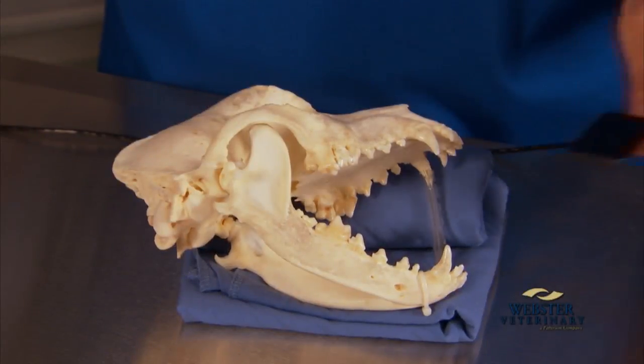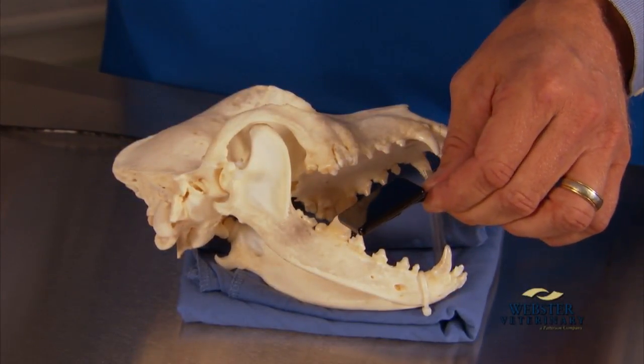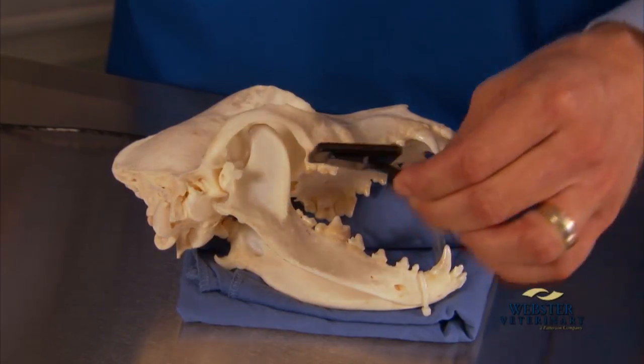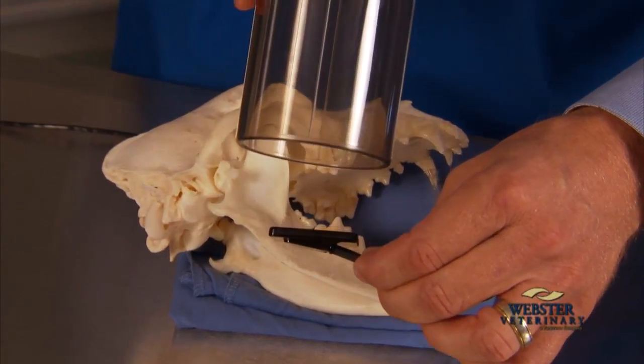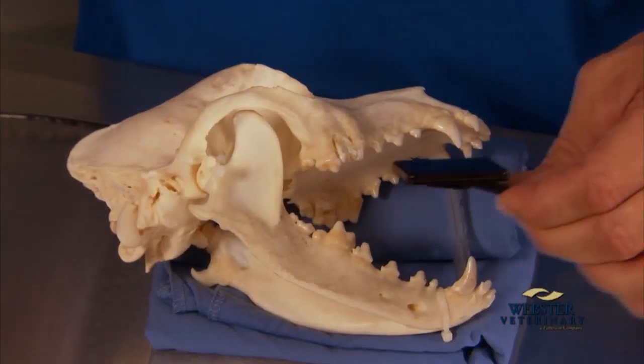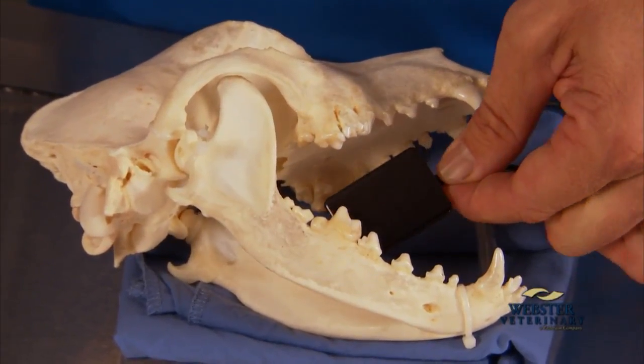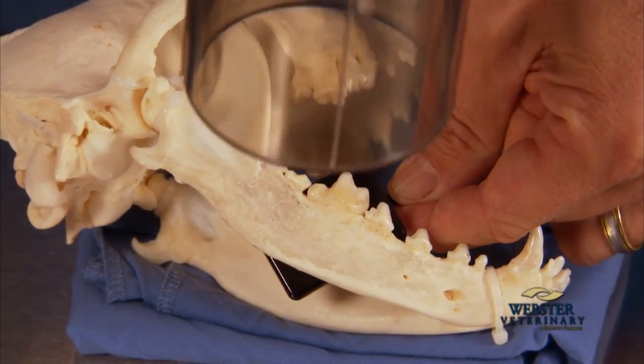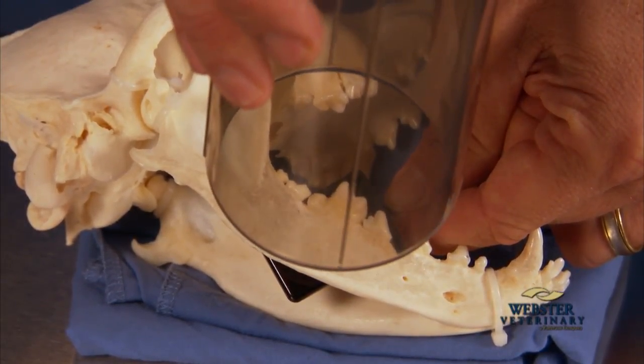When taking images of the premolars and molars of the mandible, we want to use parallel technique. Parallel technique requires that the sensor is placed parallel to the cone end. To achieve this, we place a sensor between the tongue and the mandibular teeth and move the cone end into a parallel position.